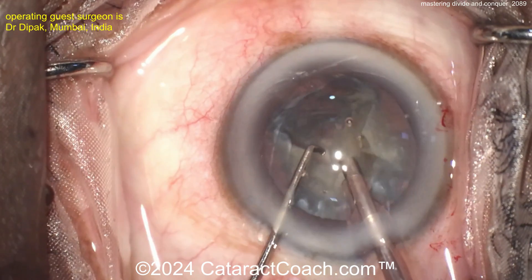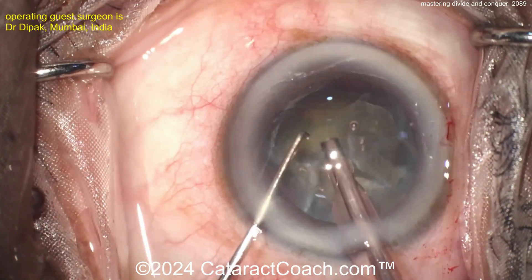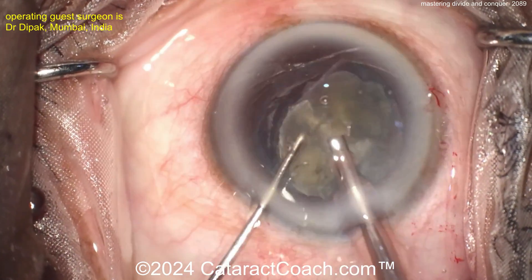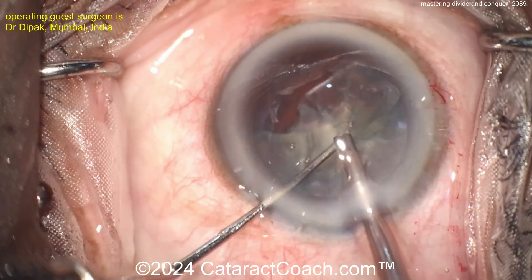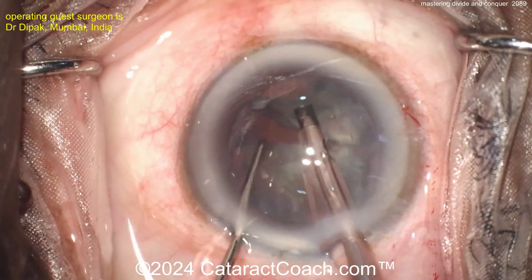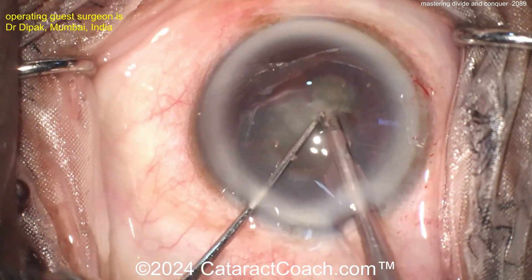Divide and conquer is usually what we start off teaching residents earlier in their career. You can certainly master this — if you've already mastered it, great. Tomorrow I'm going to show you stop and chop, and then I love to teach phaco chop. Pieces are all coming up here very nicely. Rotate, rotate, rotate — get these pieces coming up. About half the nucleus is remaining, and these pieces can be brought up very nicely.